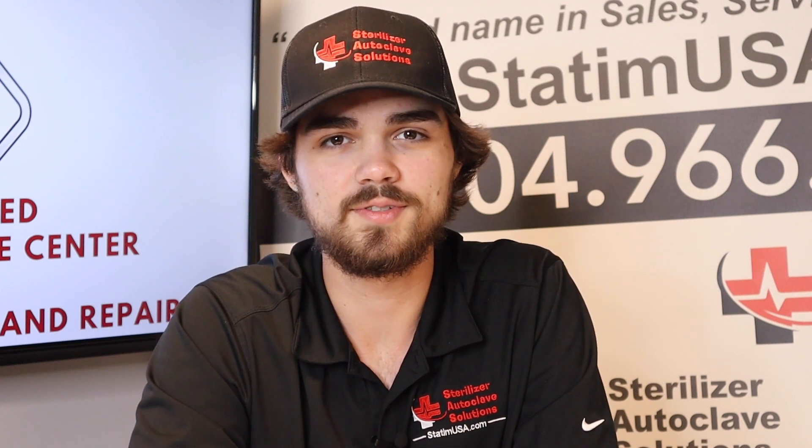Hi, this is Jacob with Sterilizer Autoclave Solutions. Today we're overviewing the W&H LexaMed, which is a pre-vacuum sterilizer.